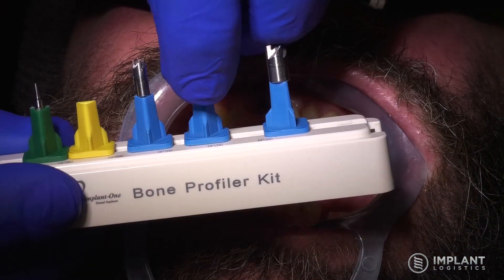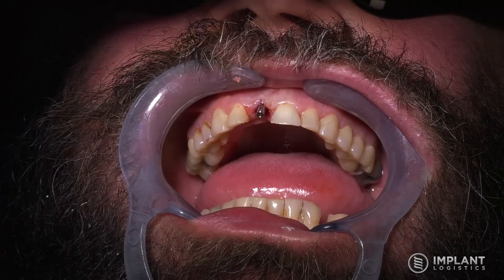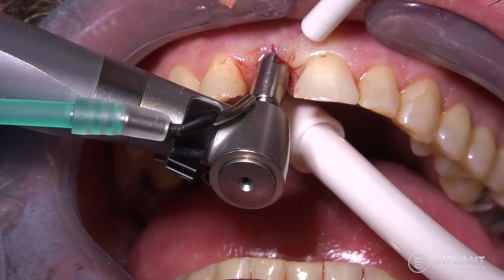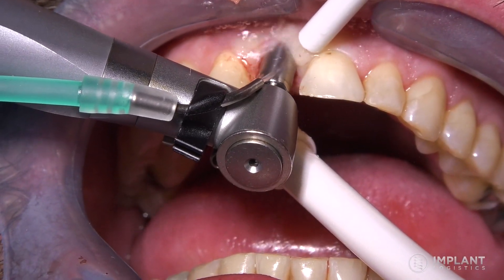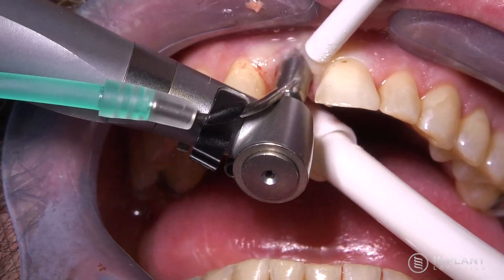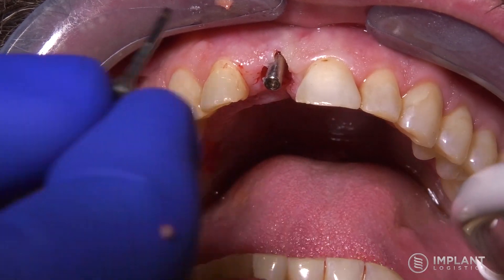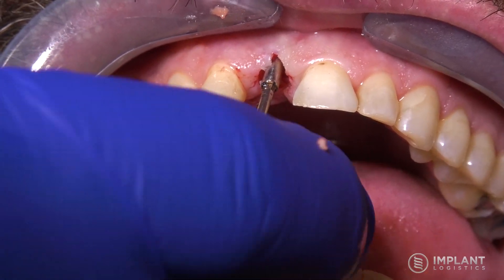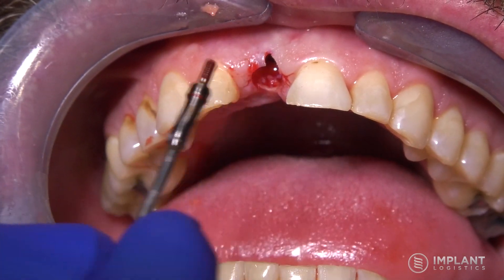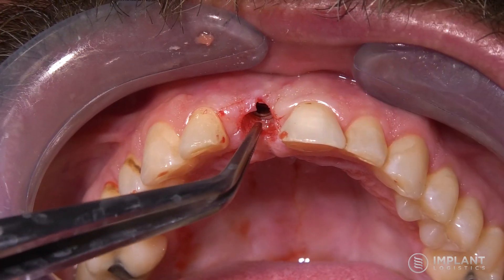The bone profiler has three different diameters. In this case we chose the middle profiler, which will take away more bone than the small one and less than the big one. We're just trying to open up the bone and tissue down to the top of the implant so that we can have the entire top of the implant exposed. If you wouldn't remove the bone, you would potentially have difficulty getting the impression post fully seated for the impression.